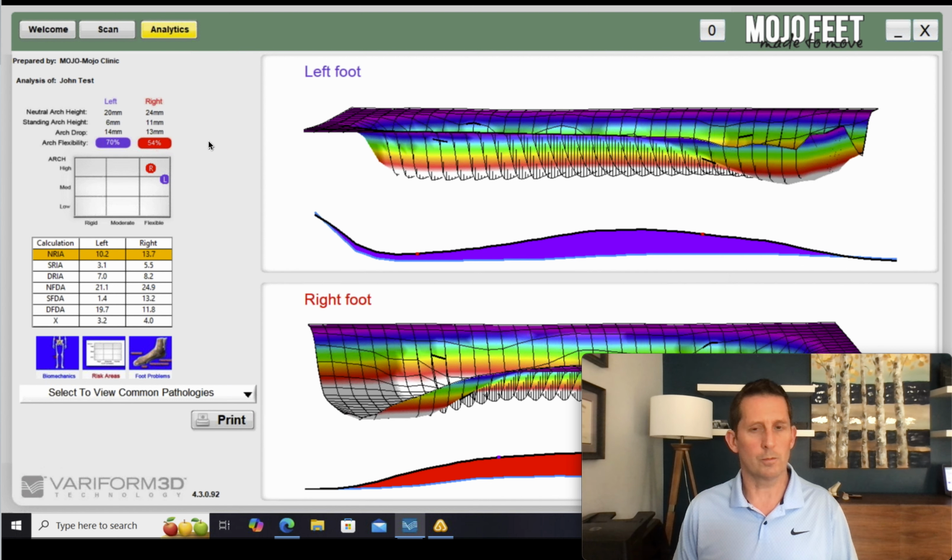So, side note, a prefabricated orthotic, or for that matter, orthotics from some other orthotic companies, aren't different right to left. So when we are talking about differences right to left, it's an interesting topic, one for another video, but I do want to point out that the asymmetric pronation can be related to some things up the chain, right? Pronating more on one side than another. And that can have an effect. It's also something that only a custom orthotic will account for.